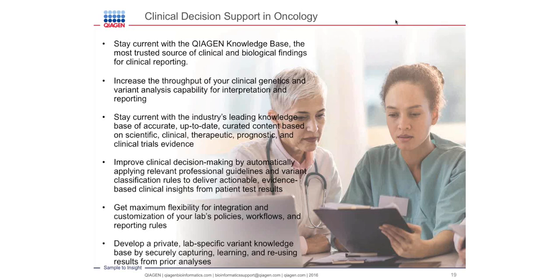So this was a poster child, basically, of how targeted therapy will help a patient who otherwise would have had no options in the clinic. Thank you very much. From a variant scientist or clinical geneticist point of view, how would QCI Interpret help a clinical lab?